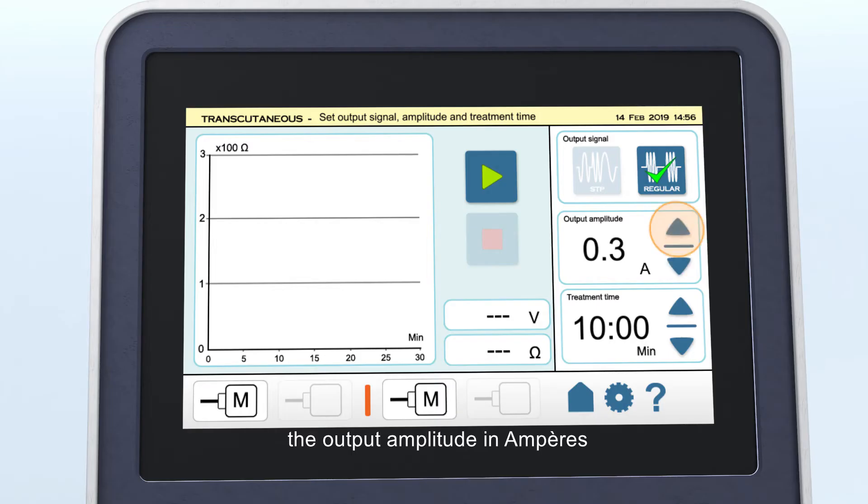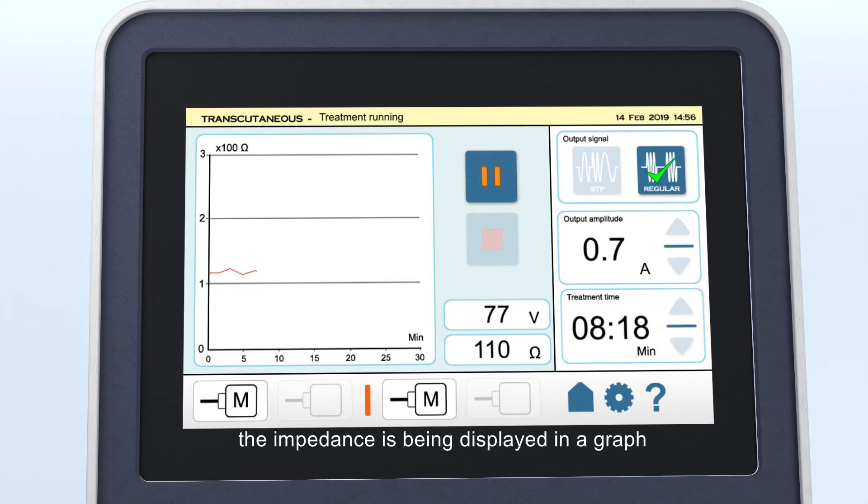The output amplitude and the treatment time can be set. During the treatment, the impedance is being displayed in a graph and the treatment can be paused.